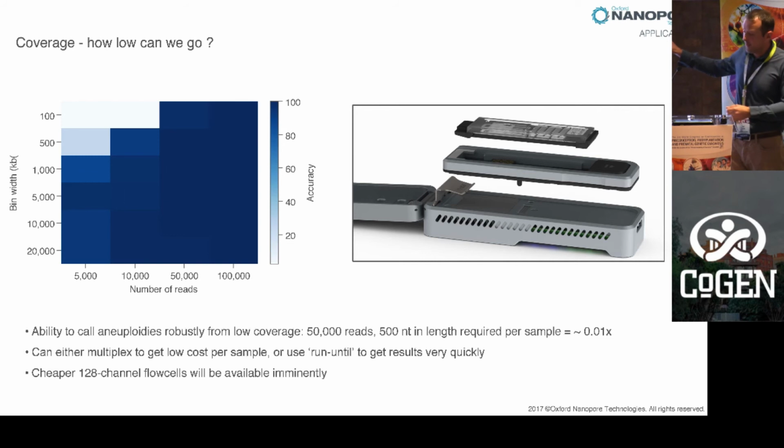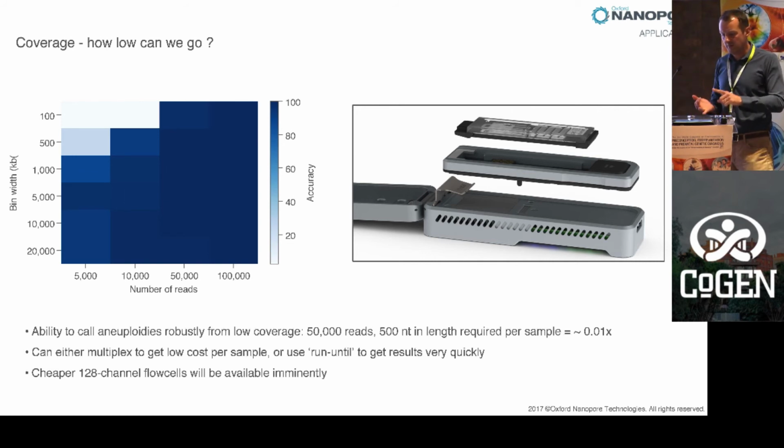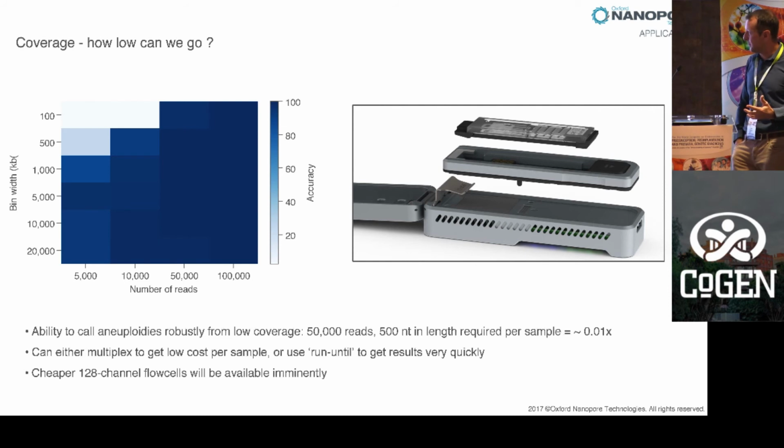Our sequencer can generate something like, in a good run, 15,000 million bases of sequence information, so 15 gigabases. The human genome is about 3,000 million bases, so 3 gigabases. So if we were to just sequence a human genome on our sequencer, we would see every base roughly 5 times, so we get 5-fold coverage.